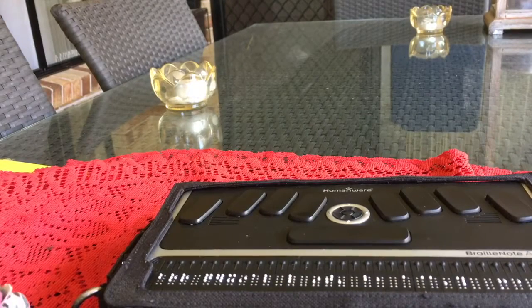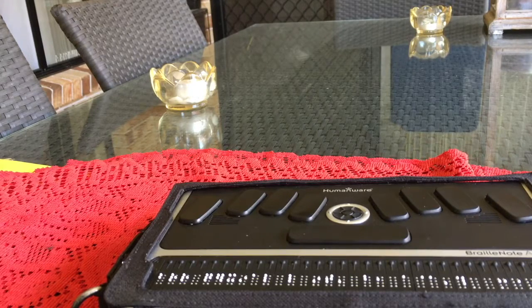Now we go back to our iPad. We go to General, then down to Accessibility, then to VoiceOver. Once in VoiceOver, go down to Braille.